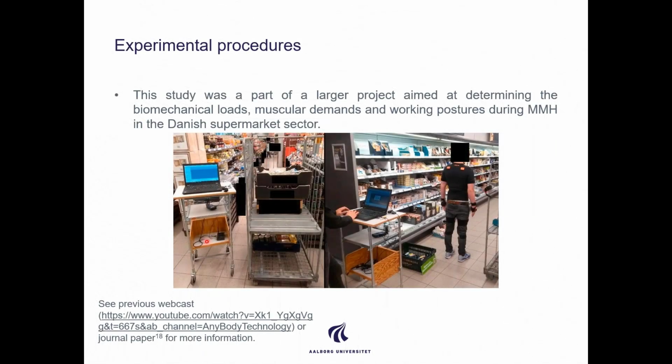Before I go into depth in the experimental procedure, I would like to say that this study was part of a larger project where we aimed at determining the biomechanical loads, muscular demands, and working postures doing different manual material handling tasks in the Danish supermarket sector.